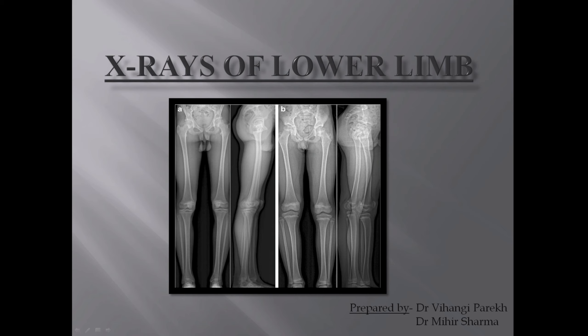Hello everyone. Today we will be discussing the radiology of the lower limb. We will be seeing the X-rays of the hip joint, the knee joint, the ankle joint and the foot. Before we start, let's get a brief idea of how we go about it. First of all, we need to know a couple more names by which X-rays are known — it is also called a radiograph or a skiagram. While explaining a skiagram, we need to mention the view in which it is taken. It could be an AP view, a PA view, a lateral view, or a dorsoplantar view. These are some of the views we use in the lower limb, and we will discuss them individually along with their X-rays.